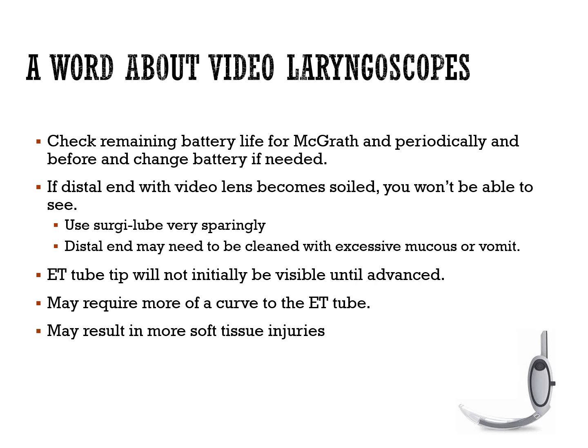It's like everything: you just have to practice and become proficient with how it functions and what to expect. It may require more of a curve to the ET tube and may result in more soft tissue injuries. These are not life-threatening injuries. These are the ones just around the mucosa, perhaps around the false cords. It's not nothing. But what they are finding is it's easier to intubate, but in some cases there's a higher prevalence of soft tissue injury around the glottis.